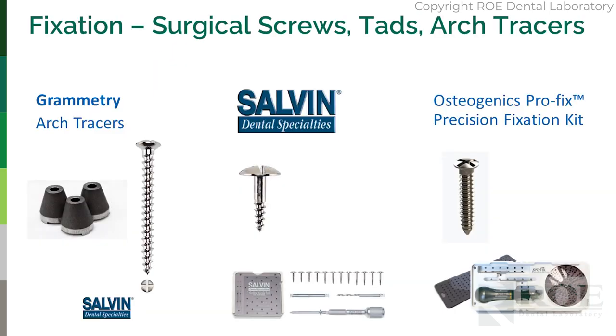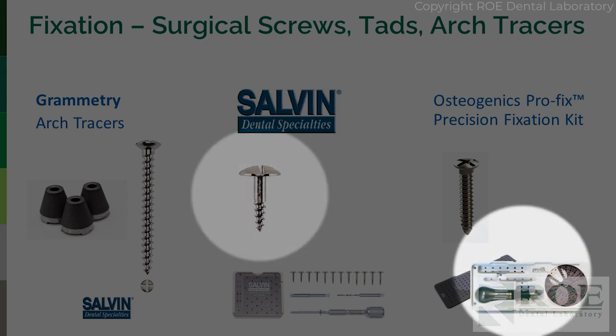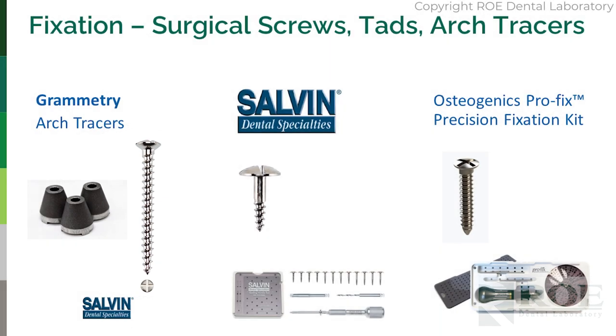Now, these screws can be purchased from a couple different companies. Salvin sells a nice screw with a big head. Osteogenics, both these companies sell really good kits with all kinds of lengths. If you're going to purchase our photogrammetry arch tracers, then you're going to want to purchase a 10 to 12 millimeter long screw. Those are available through either one of these companies. The head needs to be wider than 2 millimeters.